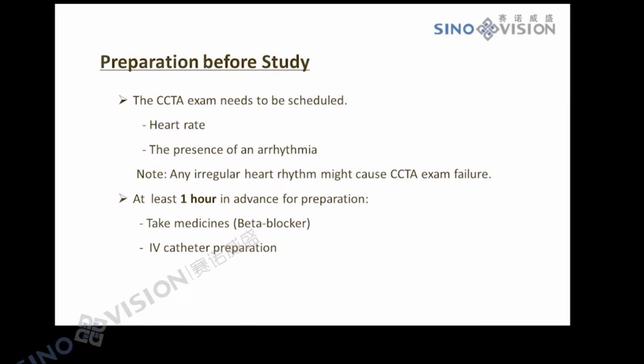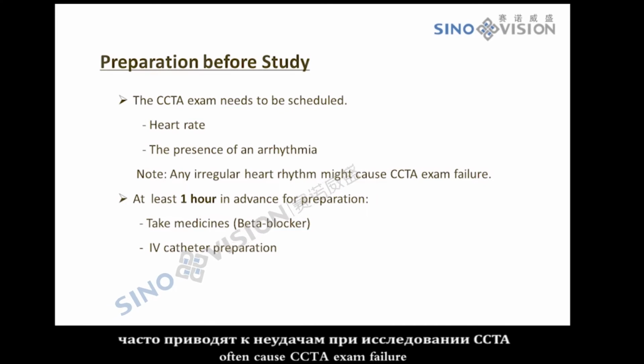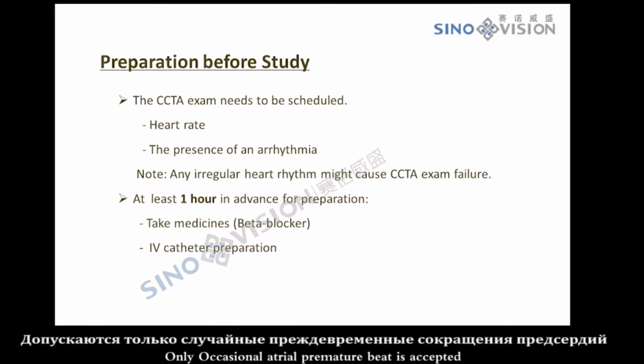Premature beats, atrial fibrillation, tachycardia, and any irregular cardiac rhythm often cause CCTA exam failure. Only occasional atrial premature beats are accepted.